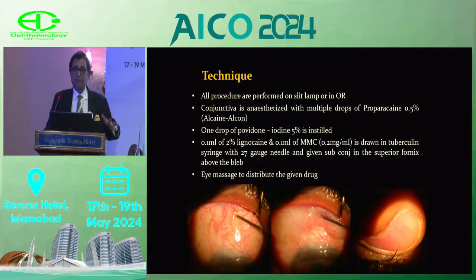The needling that the majority of the time I do on the slit lamp, because it's easy and quick. Another reason is that carrying the patient to the OR costs money. A lot of patients have already paid an amount of money to the hospital, so it is difficult to ask for increased finances. So maybe a necessity. So these procedures are done on the slit lamp or in the OR.